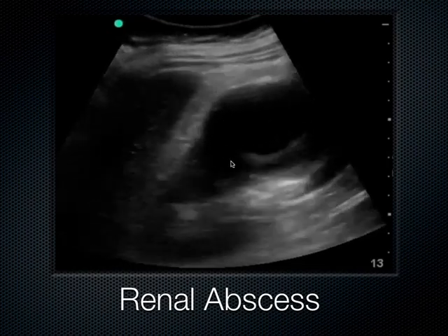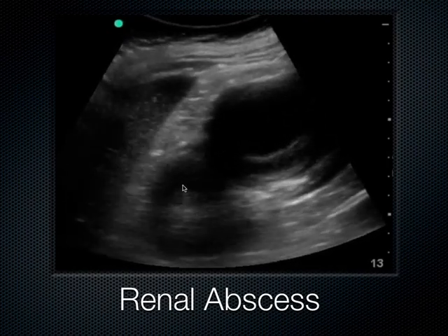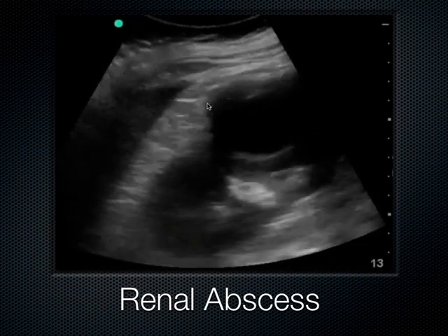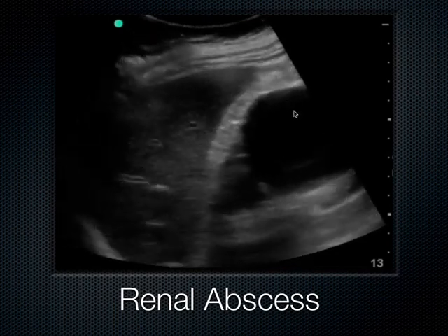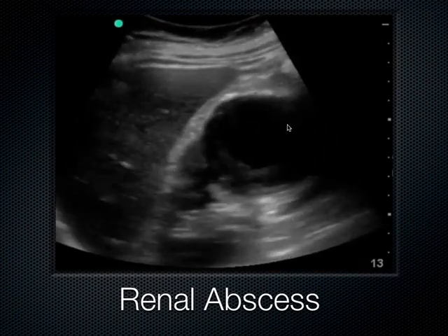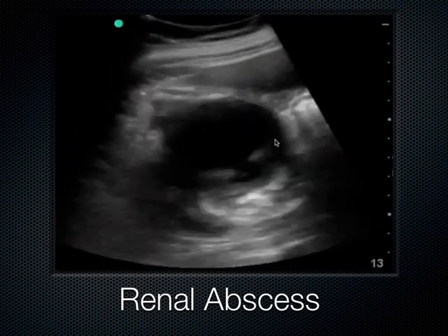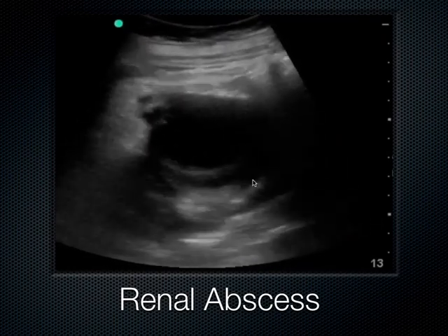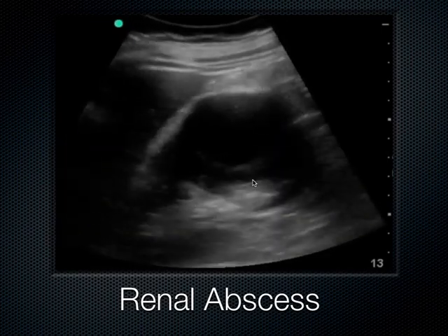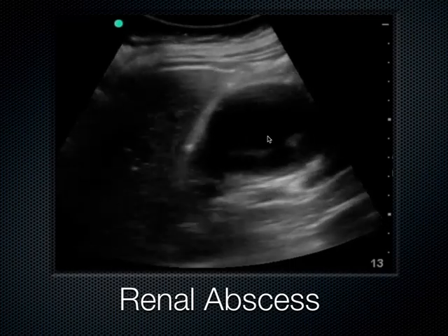You can also see an abscess in the kidney. This is a renal abscess. The normal renal parenchyma is seen down here, and when you get to the lower pole of the kidney, it's got this very large hypoechoic region in here. I agree it's a little difficult to see. I would turn up the gain on this patient. This is the liver seen here, so this must be the right kidney. They go into the short axis, and we can see this area here that looks very hypoechoic. It's within the lower renal pole, and this is what a renal abscess looks like on ultrasound.